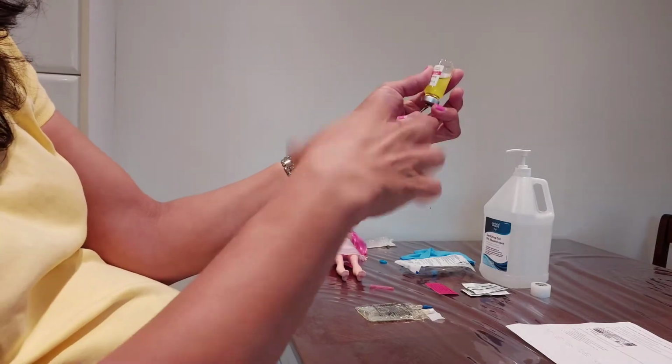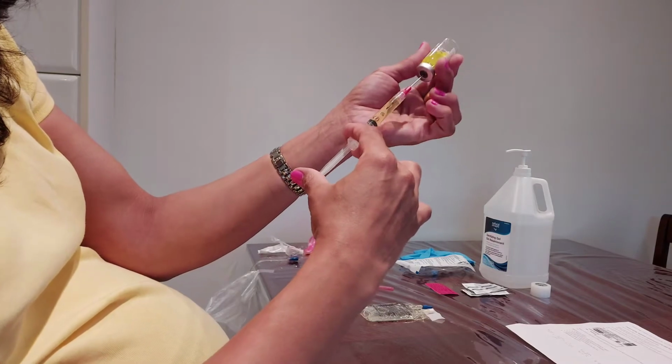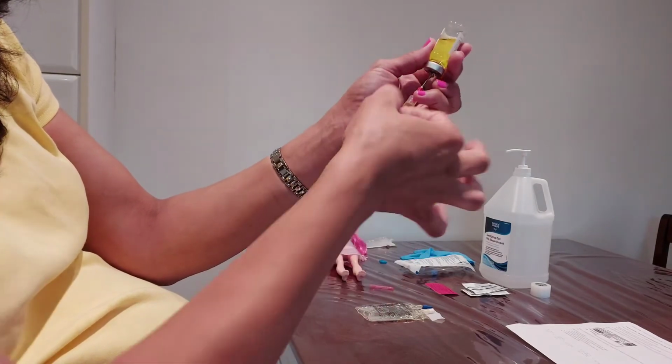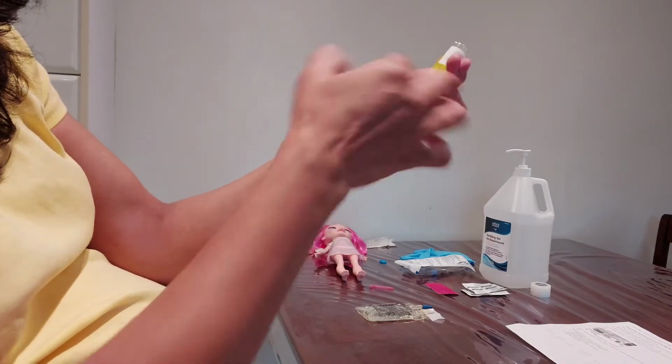I will try to dispose of the air. I don't want any bubbles, any air.